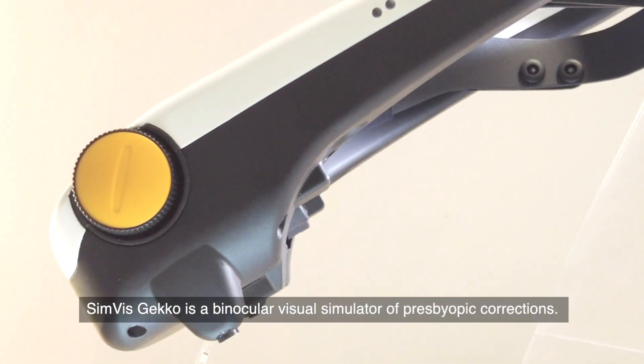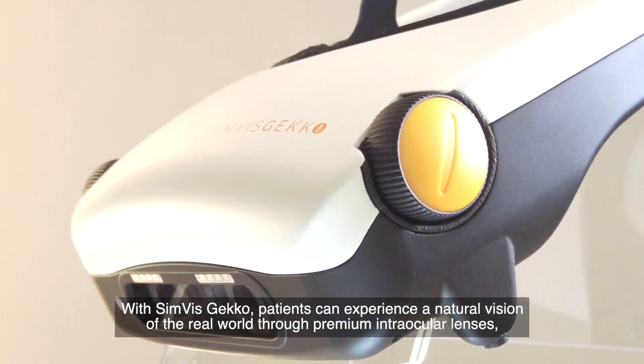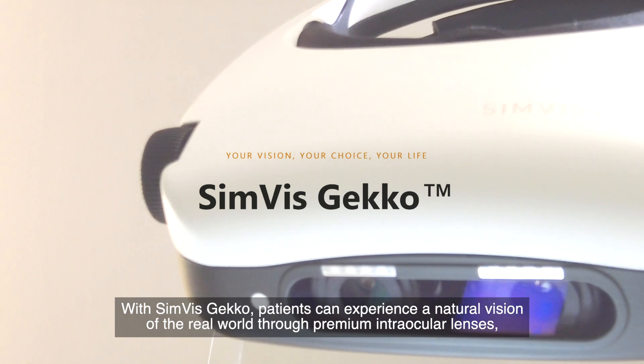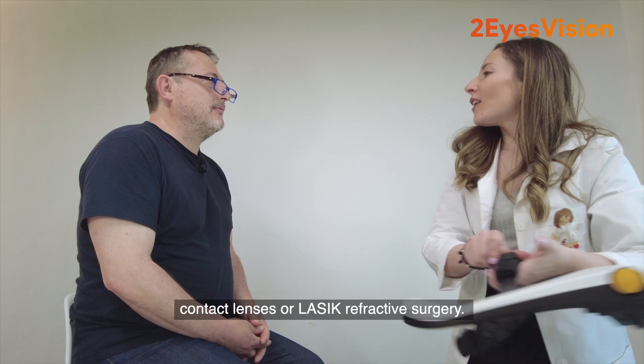Simvis Gecko is a binocular visual simulator of presbyopic corrections. With Simvis Gecko, patients can experience a natural vision of the real world through premium intraocular lenses, contact lenses, or LASIK refractive surgery.